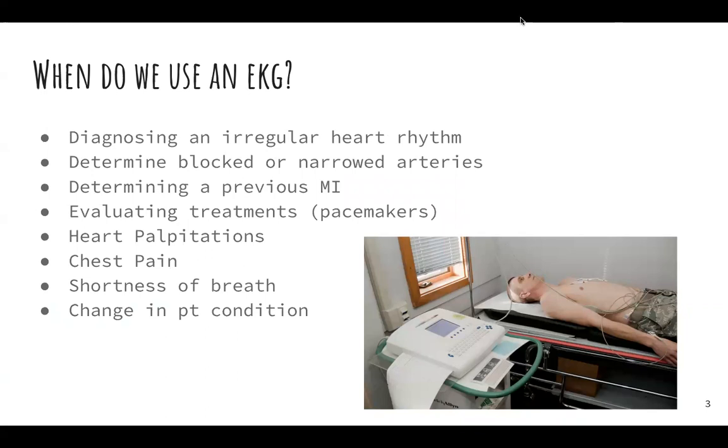So more specifically, when are we going to use an EKG? In a clinical setting, like a cardiologist's office, they're probably sent there for that reason. They're going to have an order for it. But mostly what I'm going to be talking about is going to be centered in a hospital setting. I personally will give a lot of my information based from an ICU experience, while it is still important to understand all of this on a med-surg step down, PACU, whatever you decide you want to go into when you graduate. So most of the time when you have an EKG, you're going to have an order for it.